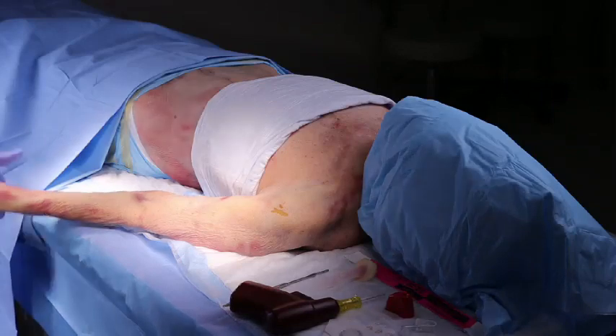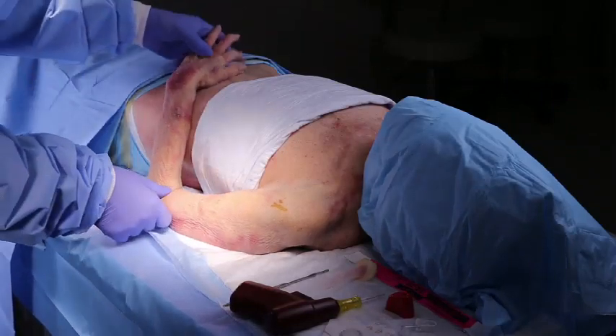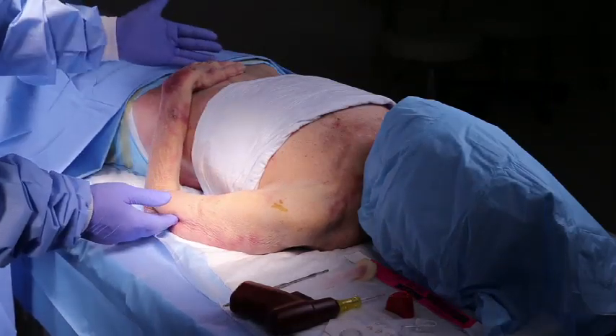Place the patient's hand over the abdomen, elbow adducted and the humerus internally rotated.